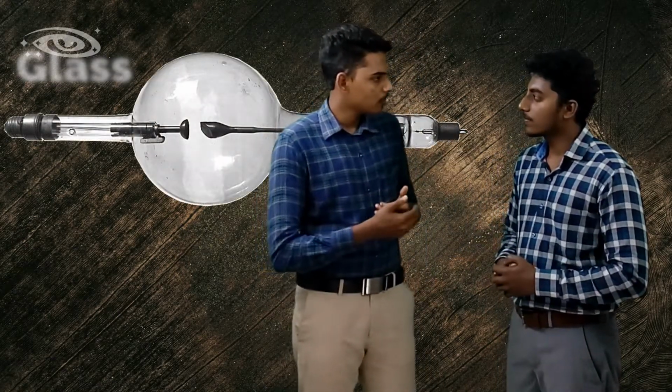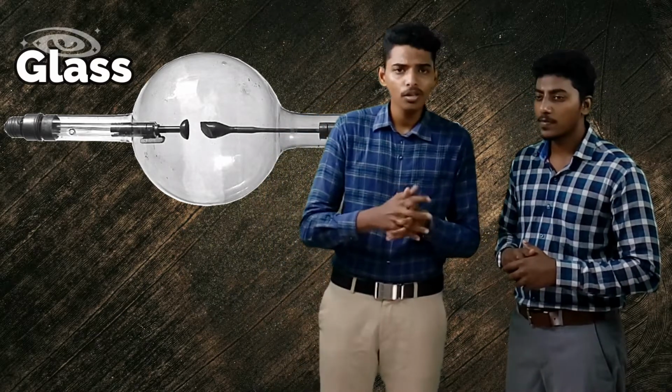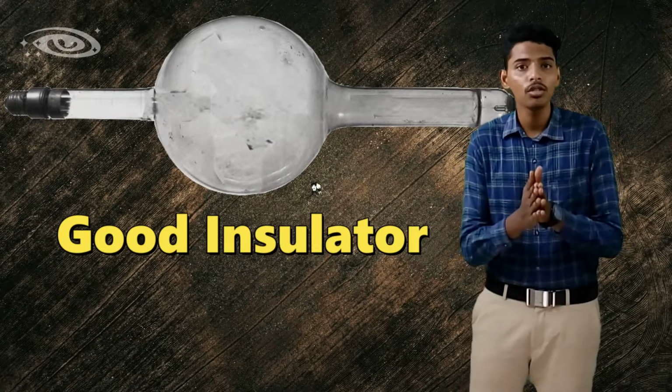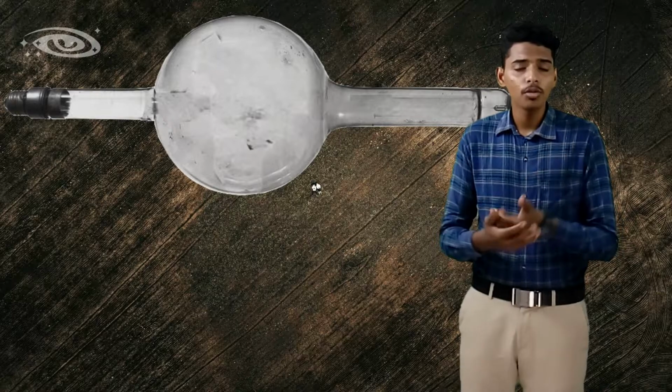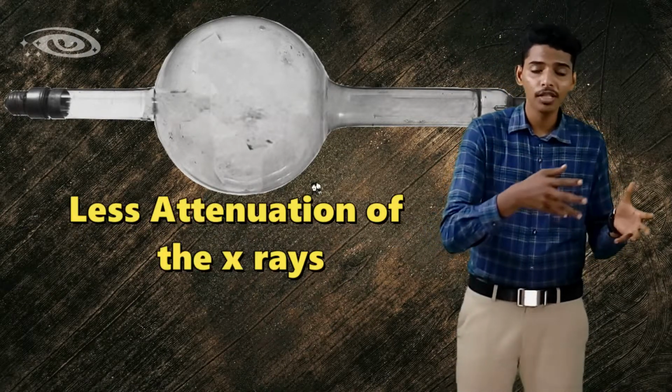First of all, we'll start with the glass envelope. Do you know why X-ray tubes are made of glass? I think because of its transparency, we are able to see the components present inside the X-ray tube. Yes, this is also a reason, but beyond this we have main reasons. Firstly, these glass tubes are good insulators; they do not conduct any electricity. Secondly, these glass tubes are vacuum tight. And thirdly, there will be no serious attenuation of the X-rays.